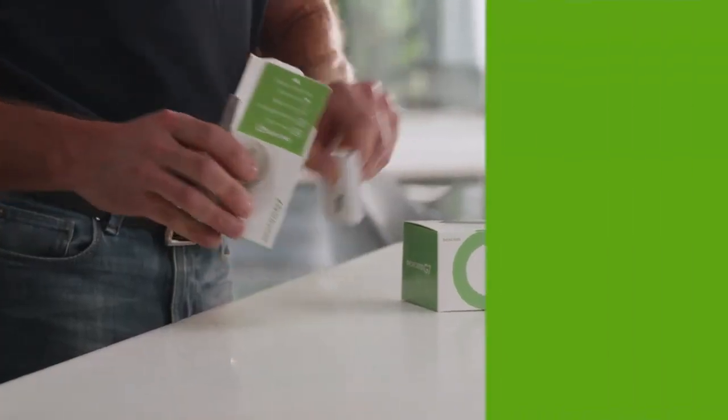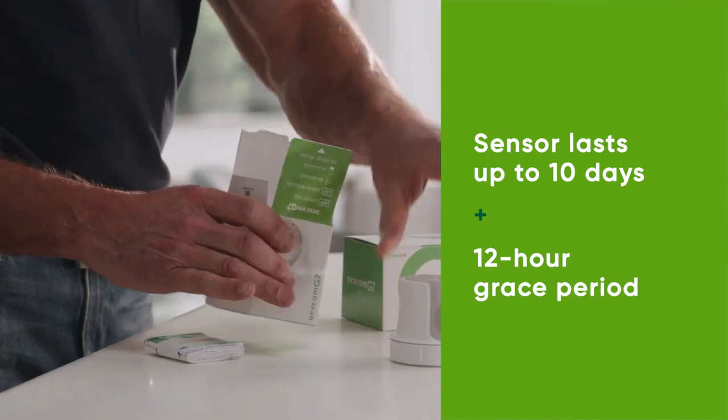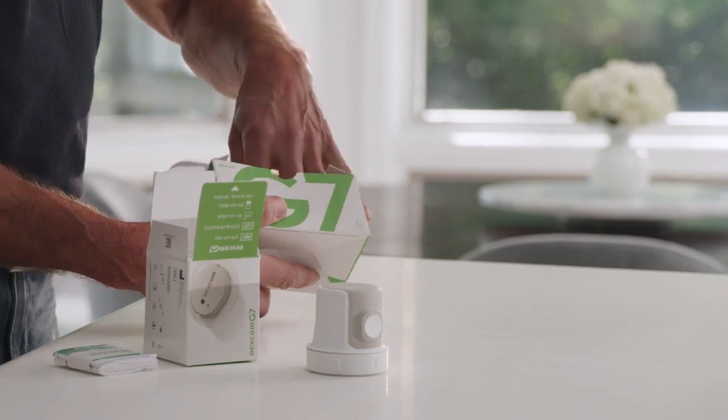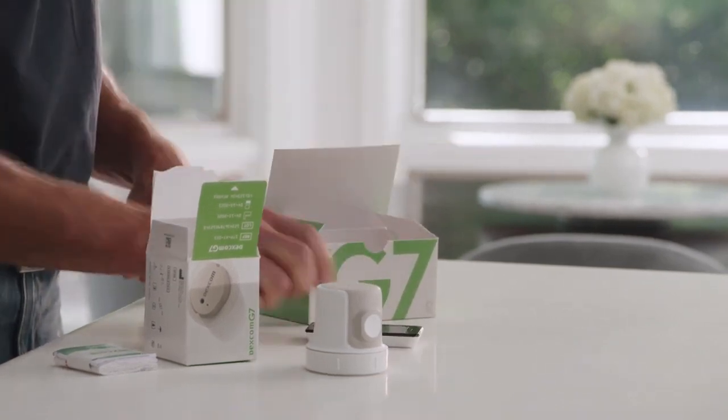The Dexcom G7 sensor box contains your applicator with built-in sensor, overpatch, and your instructions for use. Your Dexcom G7 receiver box contains your receiver, USB cable, and power adapter. Your first step is to insert your sensor.